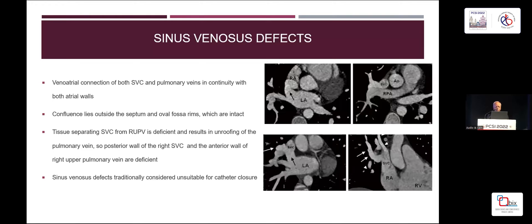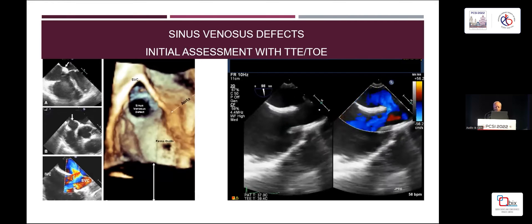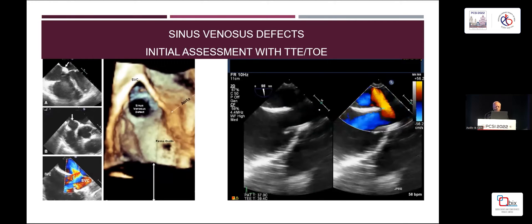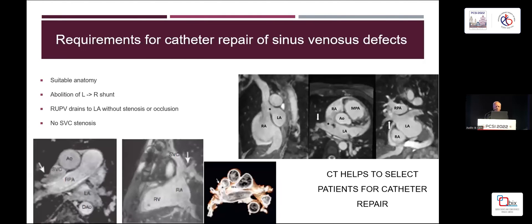The initial assessment after the normal echocardiogram is by transesophageal echo. You can see here a sinus venosus defect with left-to-right shunting and overriding of the superior vena cava. It's invariably associated with partial anomalous pulmonary venous drainage. The right upper pulmonary vein may drain in different locations — at the SVC-RA junction, a little bit higher up, or even further higher up. That's an important part of the evaluation to look at defect suitability for covered stent implantation.